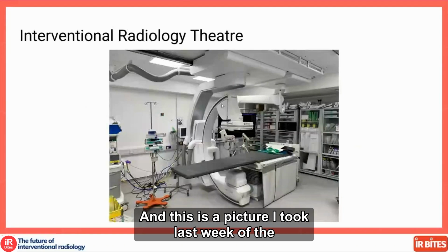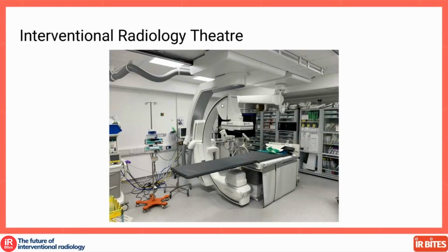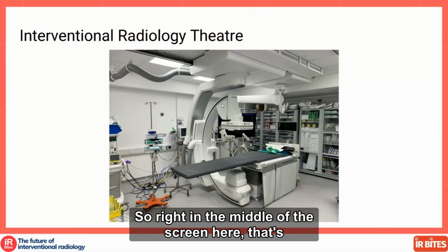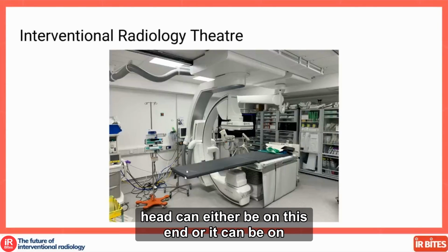And this is a picture I took last week of the interventional radiology theatre in Southampton. This picture looks a bit busy. There's lots of things going on here, and I'll break it down for you. Right in the middle of the screen, that's the table where the patient will lie. The patient's head can either be on this end or on this end.